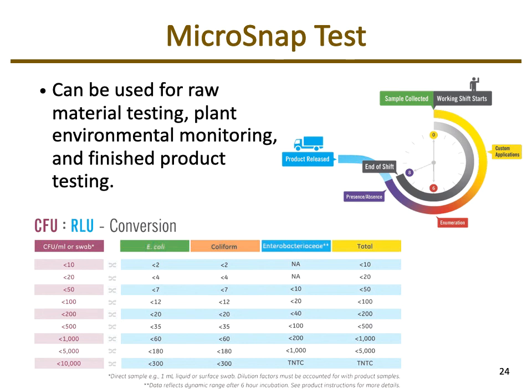The other benefit is that based off of the readings they get, so relative luminescence units, that can be worked back to the traditional colony forming units per ml or per swab. So you can have an idea of the quantitative aspect to it.